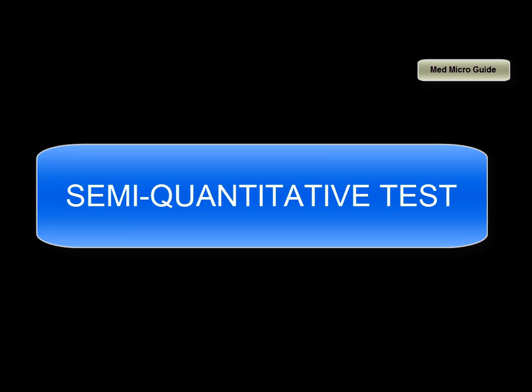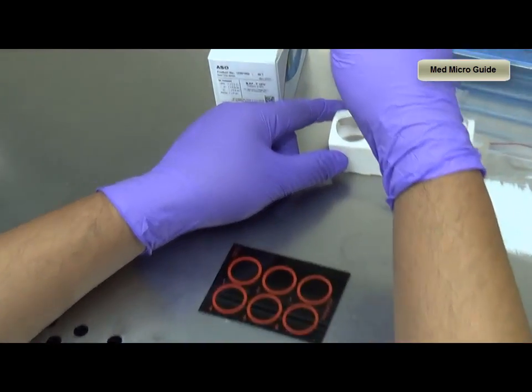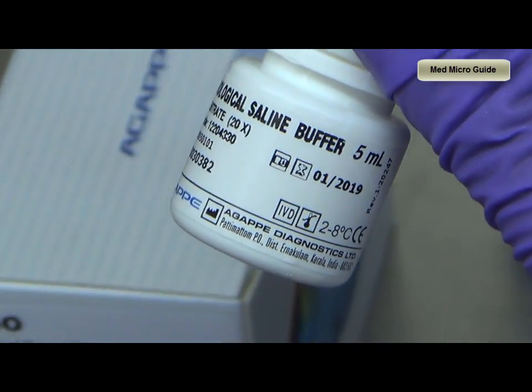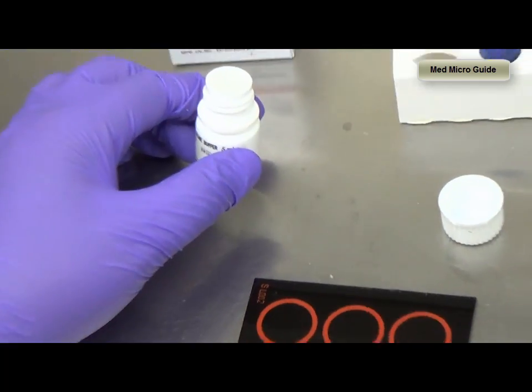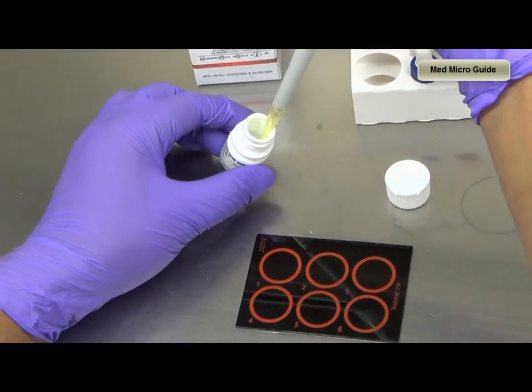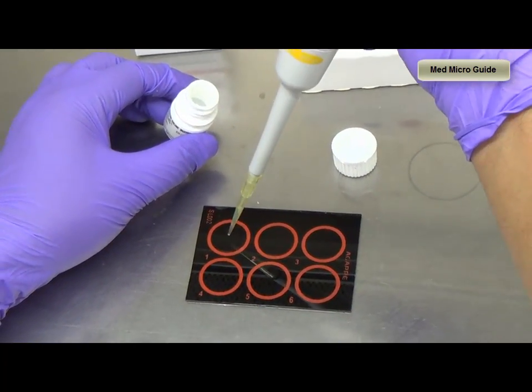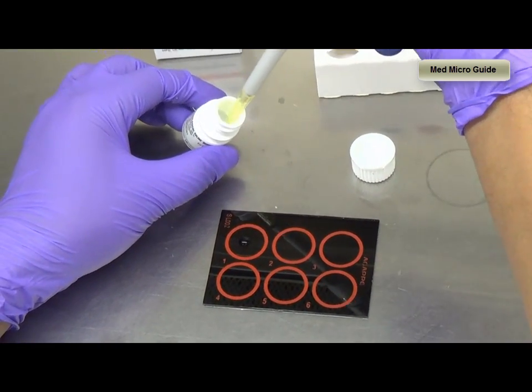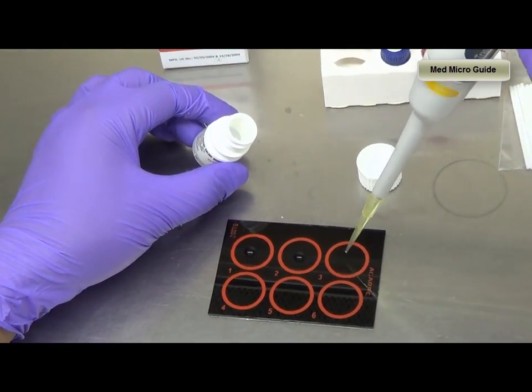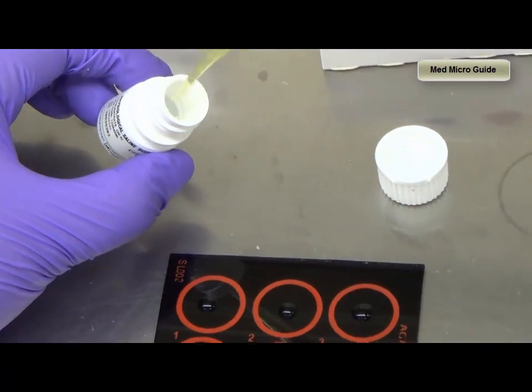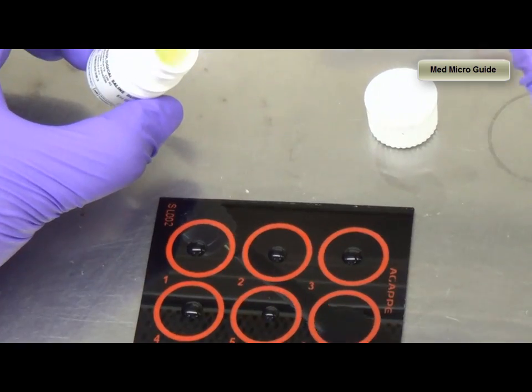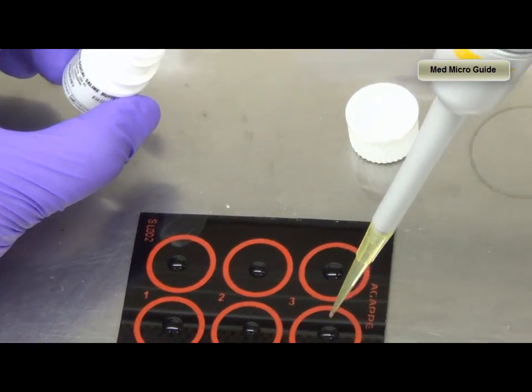If the qualitative test is positive, then we have to continue with the semi-quantitative estimation of ASO. Semi-quantitative estimation is done by diluting the serum with physiological saline buffer. The physiological saline buffer provided will be 20x concentration, hence we need to dilute the buffer before we use it. 50 microlitres of 1x buffer is added to each of the 6 circles in which we are going to dilute the test serum.